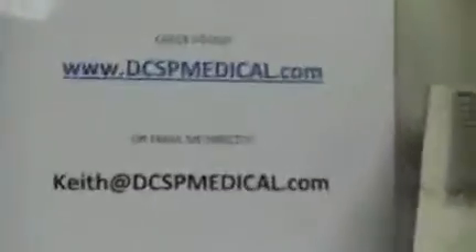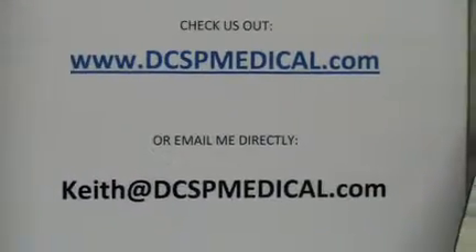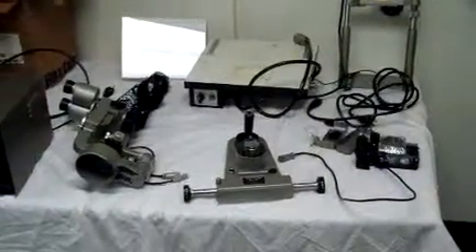If you have any interest or would like more information, you can reach me at our website, my email, or directly through the YouTube site. This is a Topcon SL5D slit lamp — it was damaged in shipping and can now be had at a very reasonable price. This also comes with the camera back, which is the AM-SL.